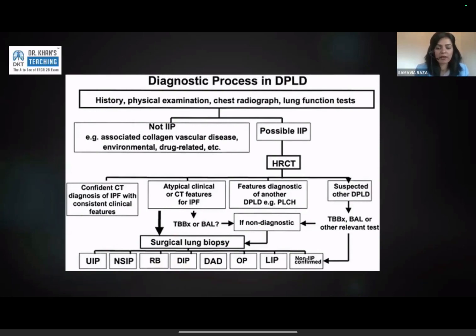The respiratory physician and I will discuss the scan in the ILD MDT. They will say, are you fairly confident that you think NSIP is the best fit? And I will say yes. Then we look at the few diseases that can give an NSIP pattern of ILD, and those have specific tests that the physician will do based on how the patient presented, and that's how the diagnostic process goes. The scan alone will never give you a barn door clear diagnosis, even if you have very clear traction bronchial dilatation, honeycombing, all the tick points, and you say definite UIP pattern of lung disease consistent with IPF.